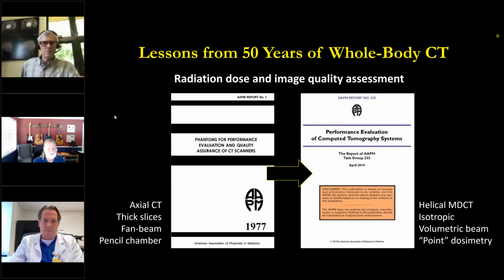Also, the FDA has sort of agreed to defer to the international body called the International Electrotechnical Commission, and they develop standards for a wide cross-section of devices in medicine, including CT scanners. And so I participated in that, and so has Dr. Sivertson. The benefit of this is that we can learn from this long breadth of experience.